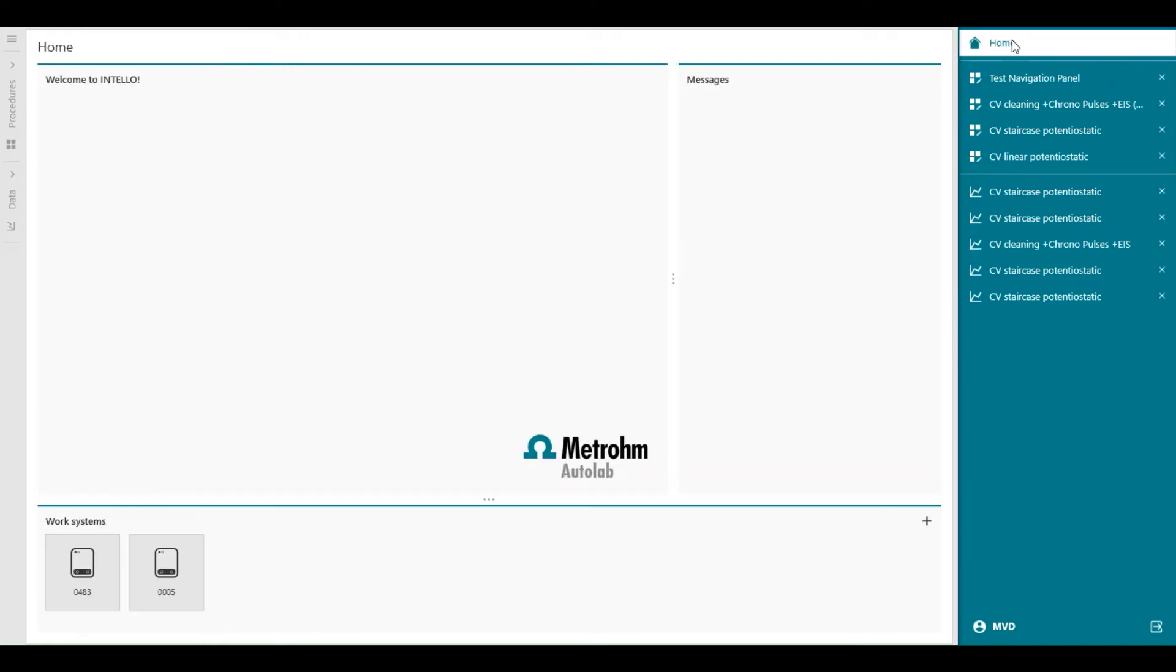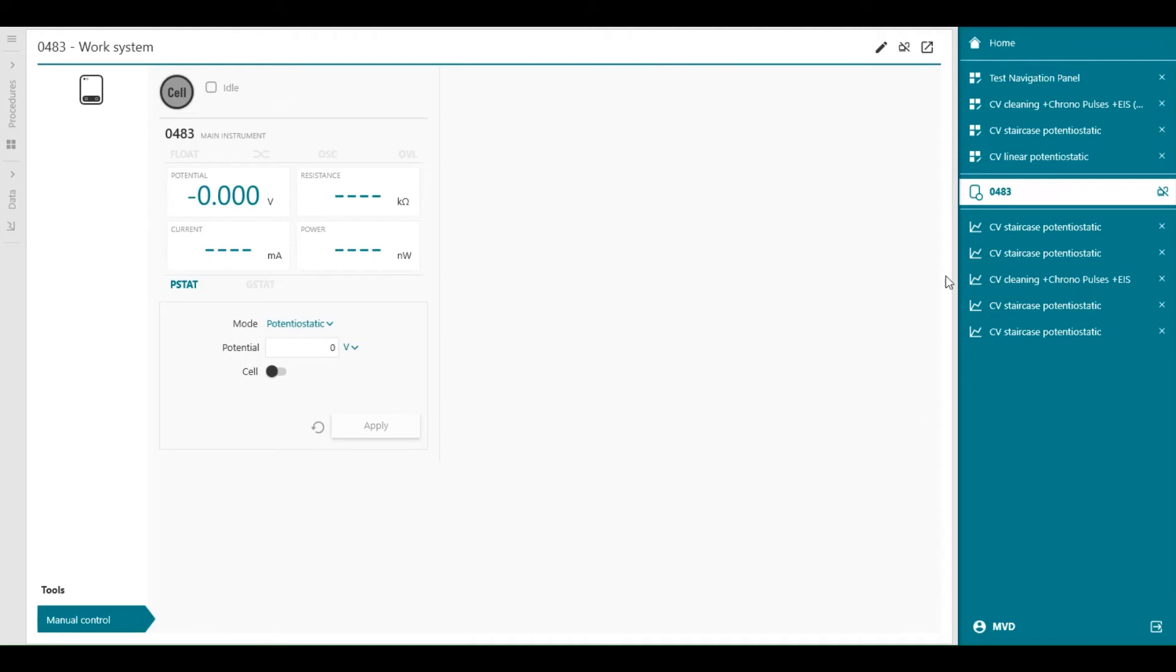We go back to home, select our instrument, and here we can claim it back. Now the instrument is back.